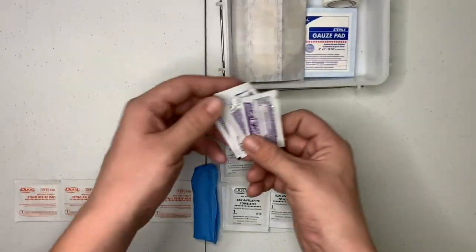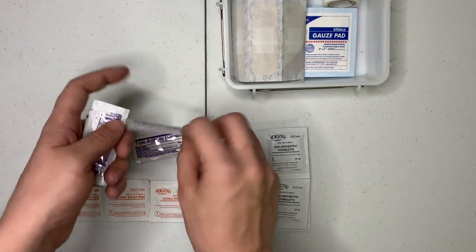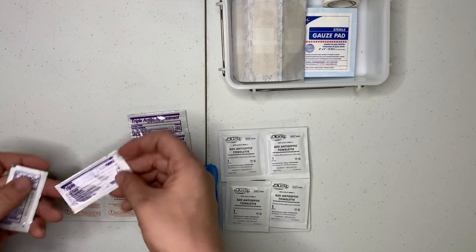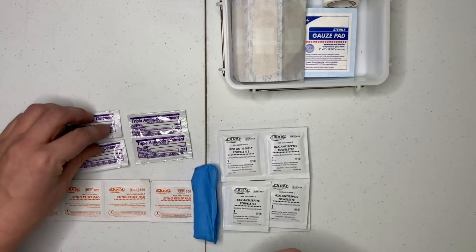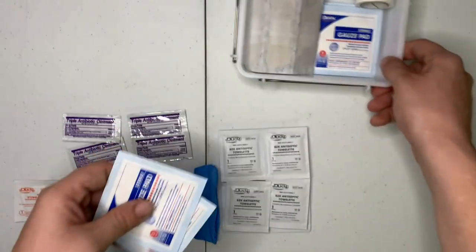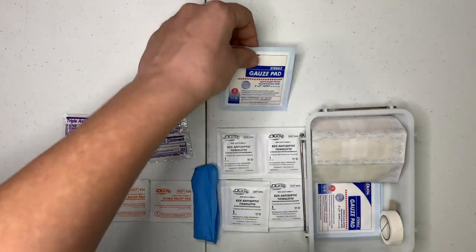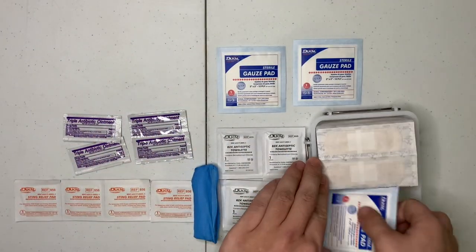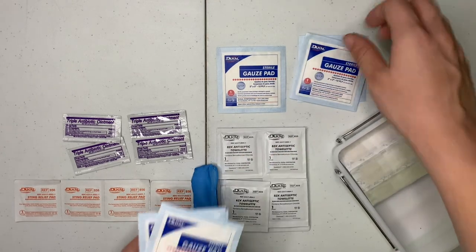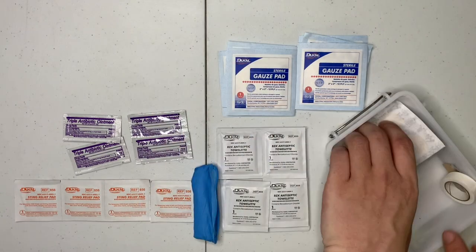Let's go for the ointments first. We have our antibiotic ointments. Then we have our sterile gauze pad. This kit can actually do some stuff, because it's got a good amount of gauze pad, that's for sure.